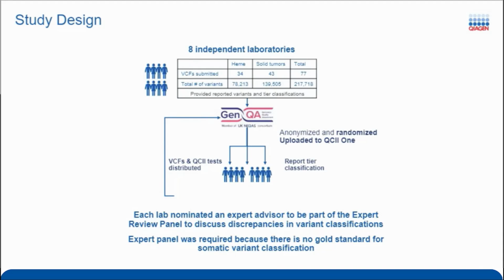So with these changes, I know that this study actually led to some updates and improvements in the bioinformatics tools, such as properly matching MF to the correct disease or giving a warning. There have also been changes in guidelines, et cetera. I wonder, what is the thought about this? This study was just published in June or July. It didn't finish very long ago. But if we were to redo it today, do you think we would get the same or different results?